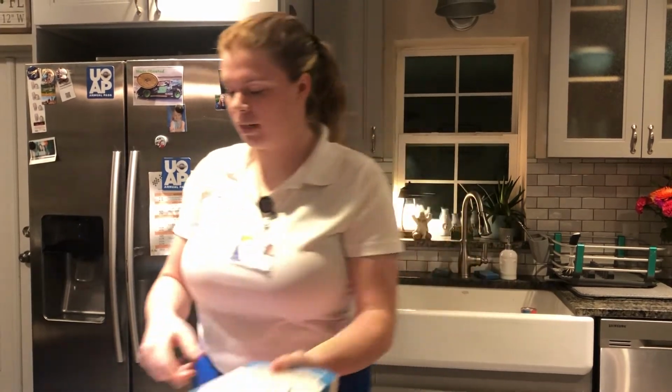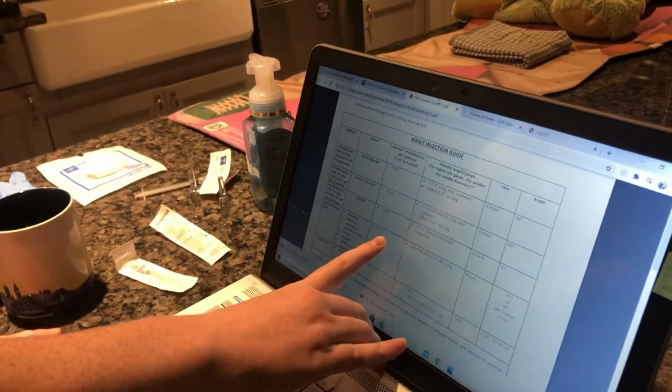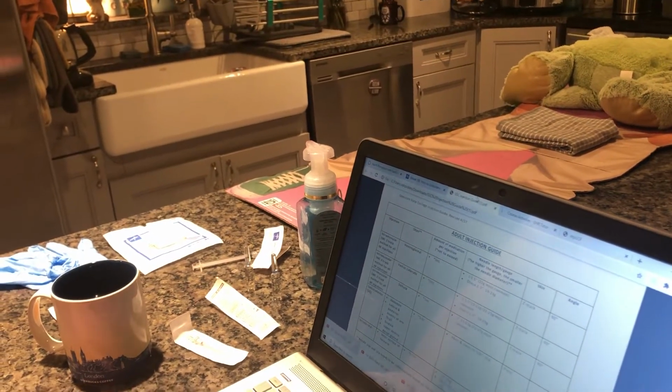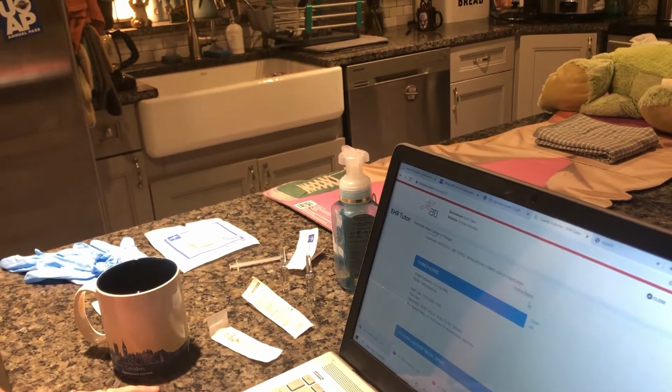Okay, I think I'm going to do the 1 milliliter syringe for this. I'm going to be using a 25 gauge 5/8 inch needle, and I'll be using a filter straw since we are using an ampule, and I've already done my calculations. We're going to be giving 0.5 milliliters. This is all, of course, referenced in our SSC injection guide, which is right here. So we have the subcutaneous, we're giving it to the thigh right here, and then these are the measurements that we're going to be using. Oh, wrong one. Okay, and after I do that, I'm gonna go ahead and prepare my stuff.